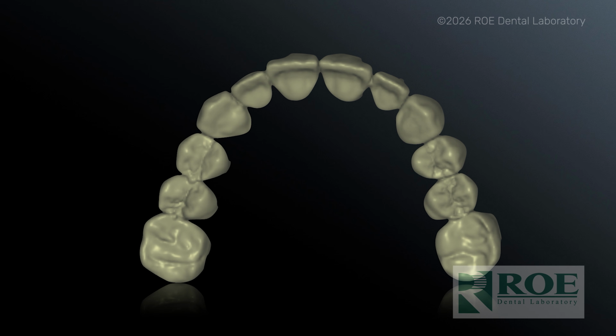We'll see you tomorrow. And what happens is they're going to come in tomorrow. We're going to cut that thing off, bust it all off because it's in the undercuts everywhere. And the tissue is going to look gnarly, but I don't care, because between right now and tomorrow, I have calm time with the patient not in my chair to then fabricate these new prototypes.